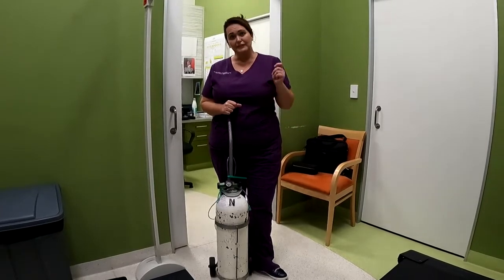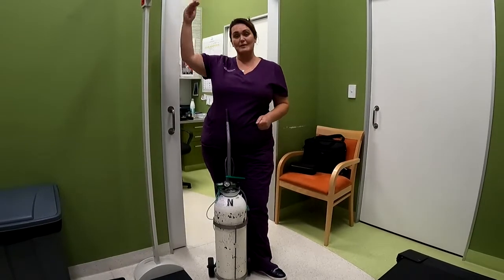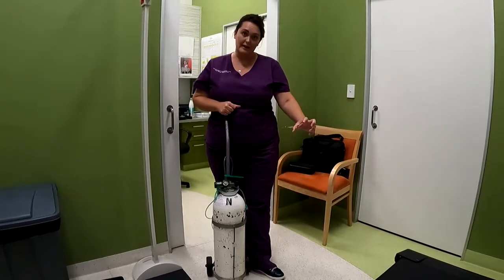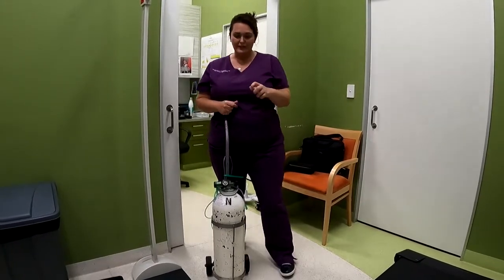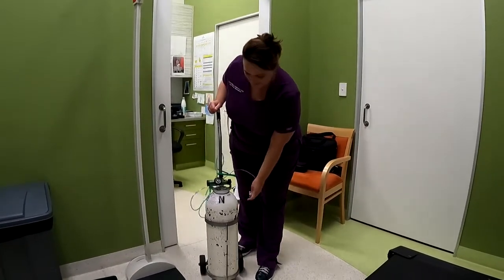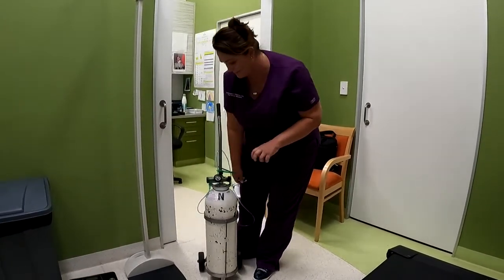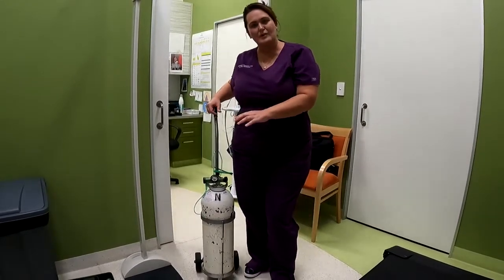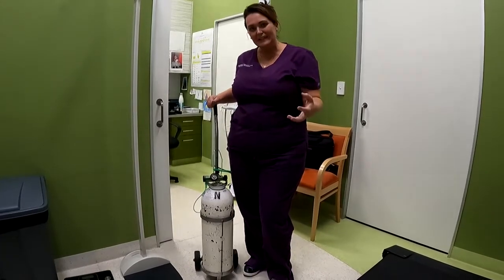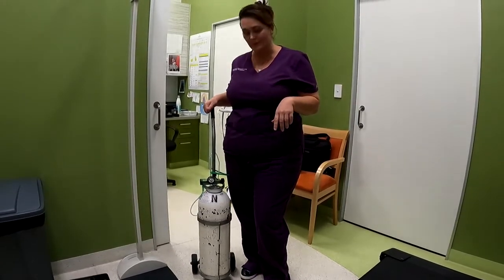The other thing I suggest is if you're finding you're going from your big tanks a lot, so say if you've got a 2-story house and you're going from upstairs to downstairs a lot, you could put your portable oxygen regulator on your other big tank so that when you're changing over, you're not having to change the regulator all the time. You're just able to disconnect your oxygen and move it to the next tank and regulator. If this isn't making sense at the moment, it will once you have your oxygen delivered and they go through it with you. But again, please, if you have any questions at all, just give me a call and we can go through it over the phone as well.